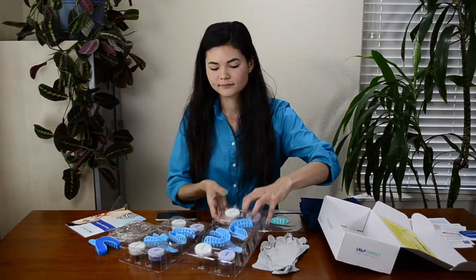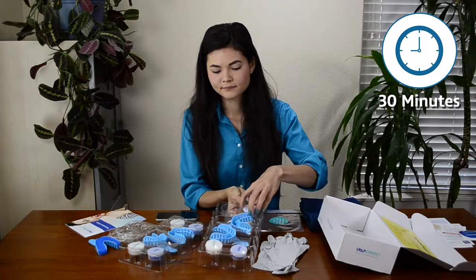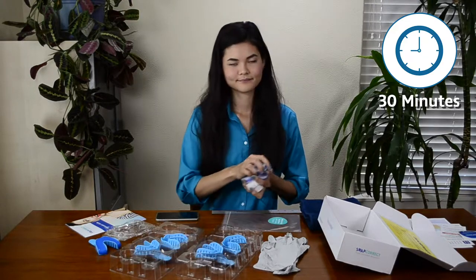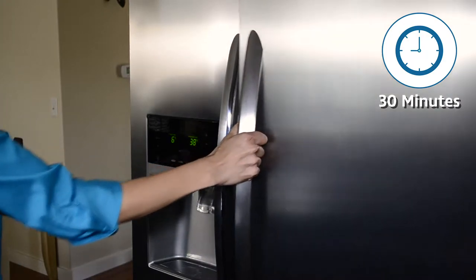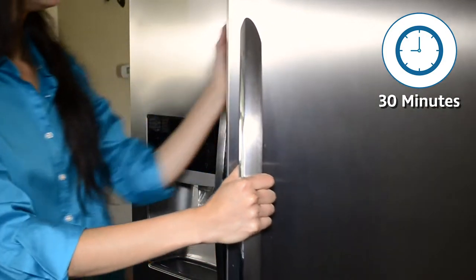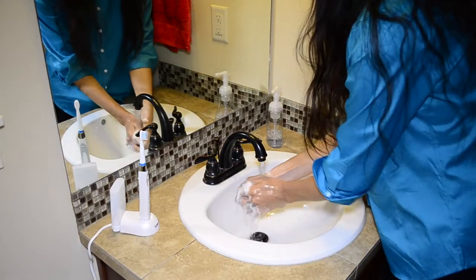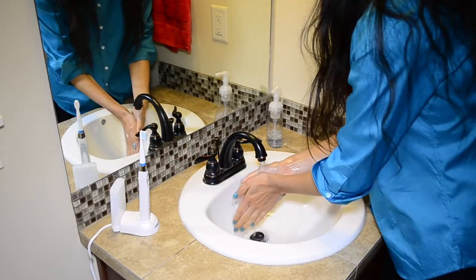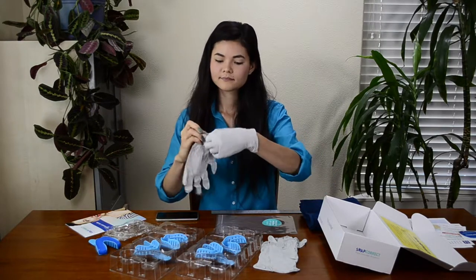Before you start, refrigerate all four sets of putty for a minimum of 30 minutes. Chilling the putty will extend the window of time before the putty sets permanently, allowing for more mixing time and more time to properly place the mixed putty in the tray. While the putty chills, take this time to get ready. Make sure to brush and floss your teeth, wash your hands with soap and water, then dry them thoroughly. Carefully choose the tightest fitting gloves provided in the impression kit and put them on.